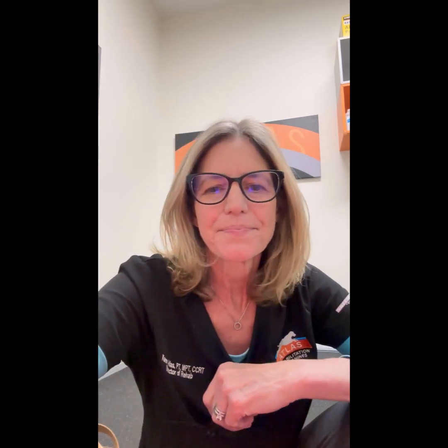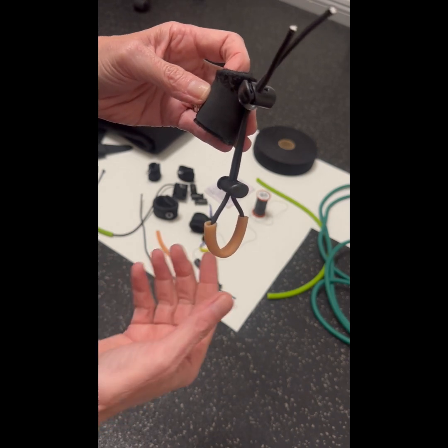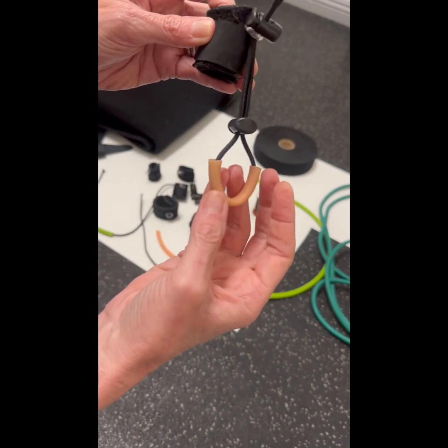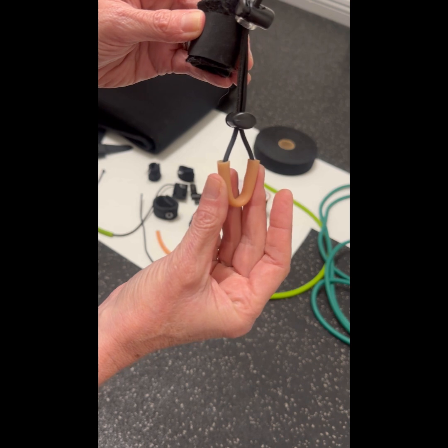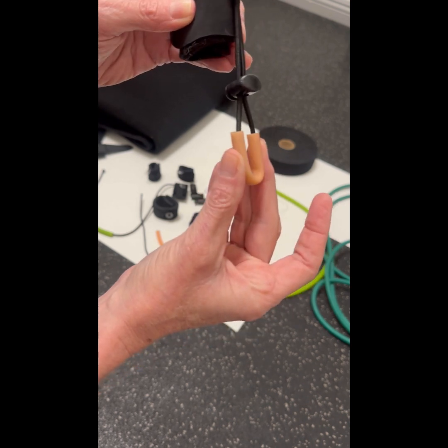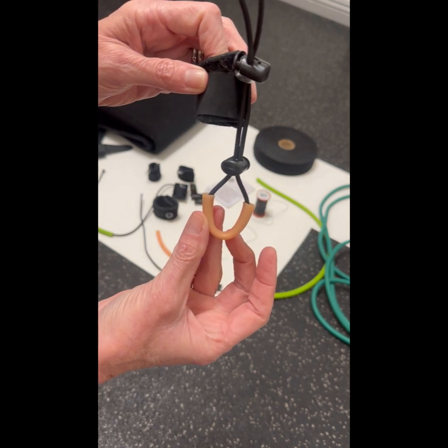This is something that you would want to use more as a training device, not something that you want to keep on all day, but you might find this helpful, so I'm going to show you how to make it. Similar to the toe up booty device, this also uses a cuff that goes above the hock. It uses elastic paracord, and then this part goes underneath the two middle toes of the paw to help keep it raised up so that it will prevent knuckling in a dog that has neurologic impairment.